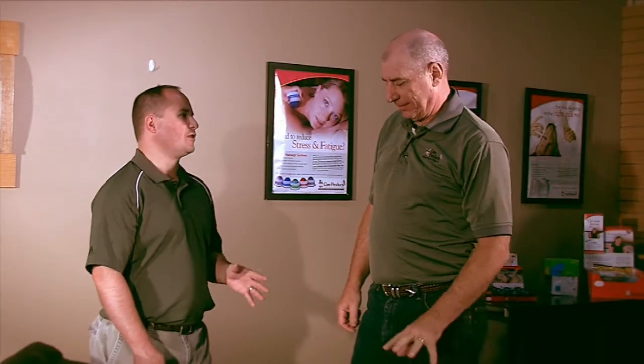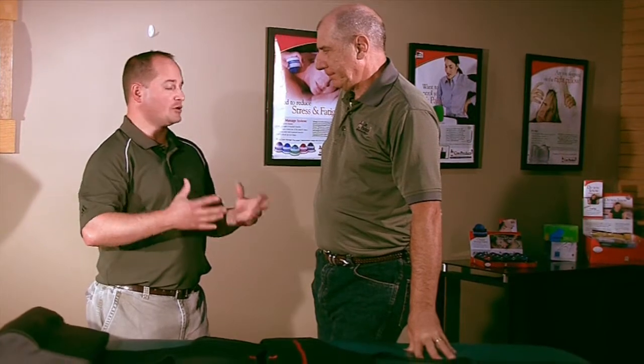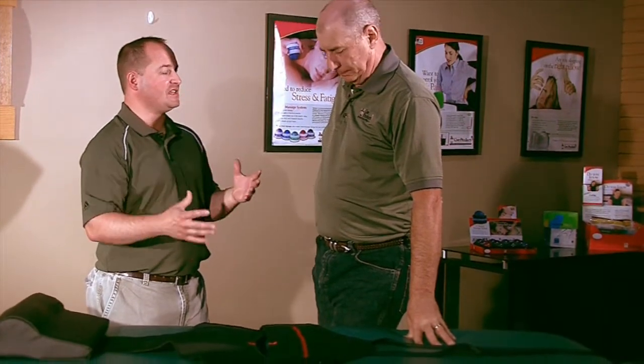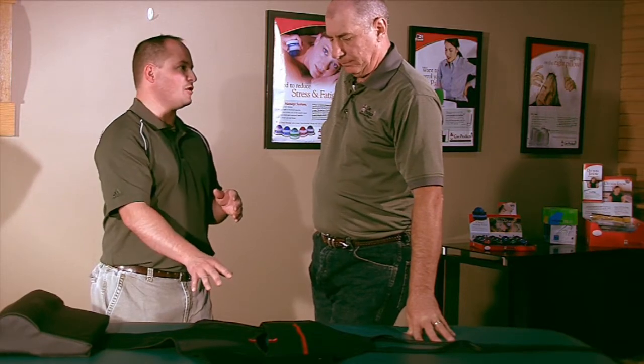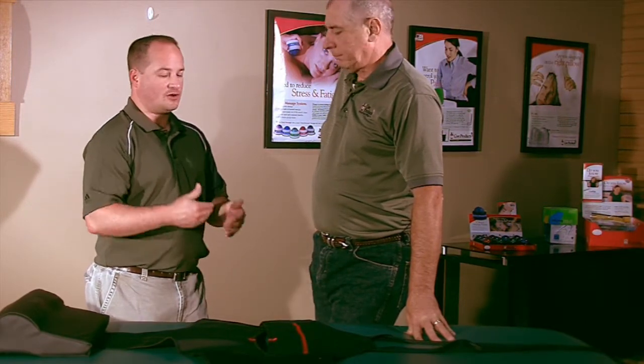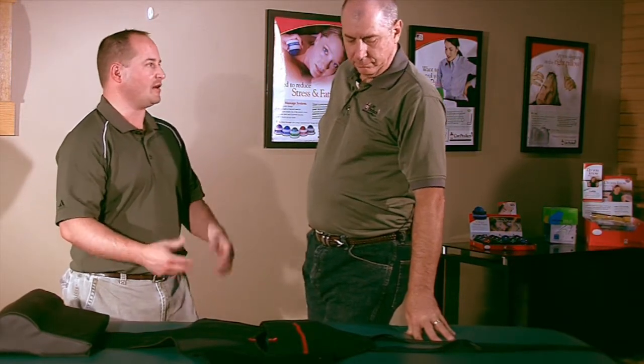Hey Rick, I know traction is a great therapy out there, but a lot of the doctors who are performing this therapy are having trouble with their belts in terms of getting them on easy, getting them off easy, and then the slippage when the patient is in it. So I know the Core Traction Harness can help with all that, but if you could go over it with me and tell me how this can be a benefit.